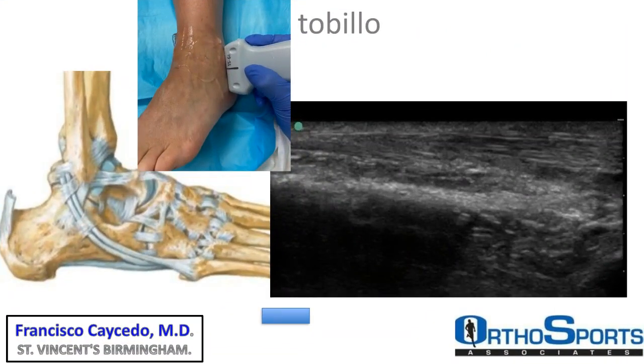Now, follow the trajectory of the tendons. So again, I start from the hyperechoic bone, slide gently backward, and I go from proximal to distal. And two very important details: you can see not only the structure, but also the diameter. When you have a pathology, and especially when it's chronic, what you see is thickness. That's one of the signs. And then you can see these patchy anechoic patterns that tell you there is rupture or degenerative changes.